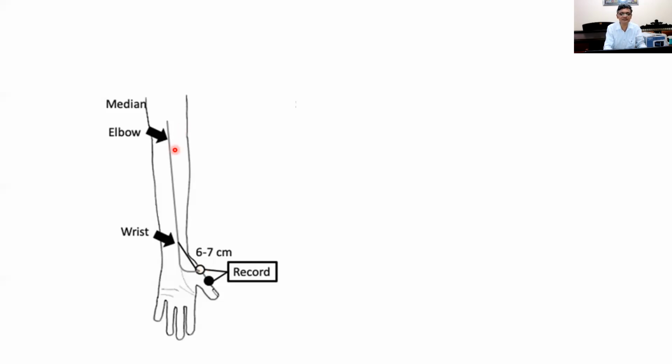Probably that is because the electrical traveling through the skin is quicker, and the recording will pick it up, so you can see a little disturbance in the recording. That is the initial beginning point, and then the impulse will come along the nerve.